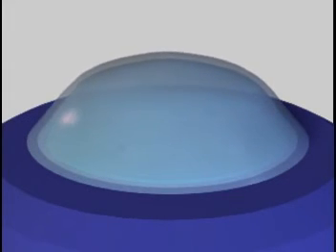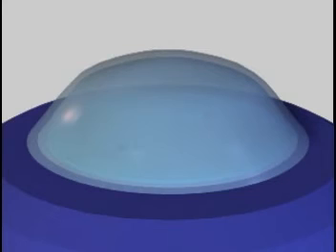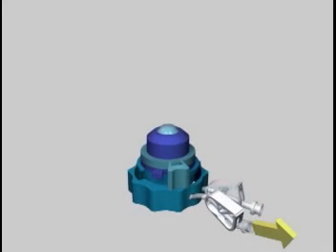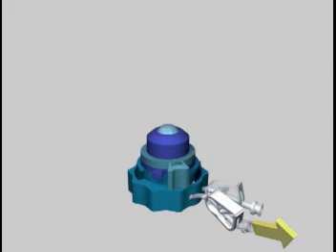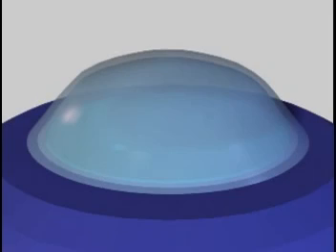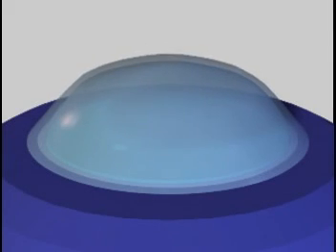Alternatively, fluid can be aspirated from the chamber. Once a comfortable chamber depth is attained, the pinch clamps can be locked to maintain the desired pressure while the donor cornea is cut using a Barron Vacuum Trephine.